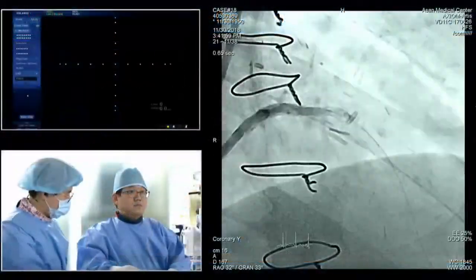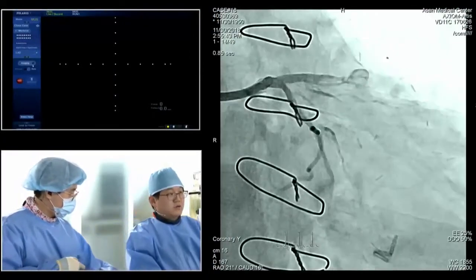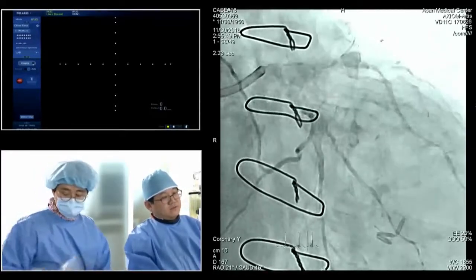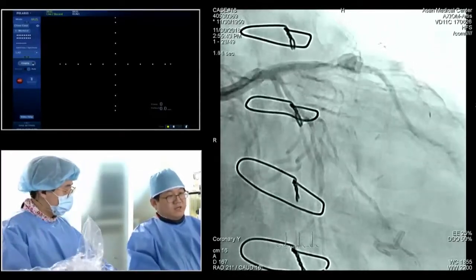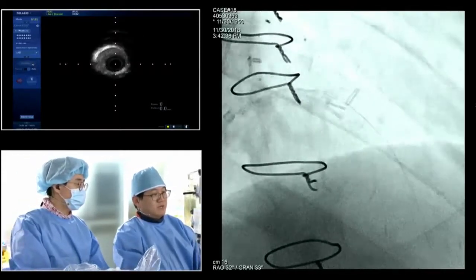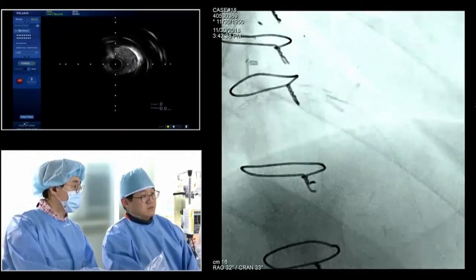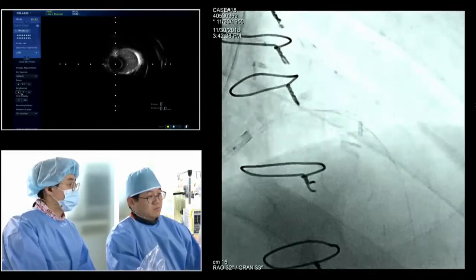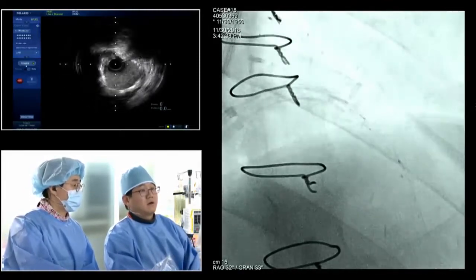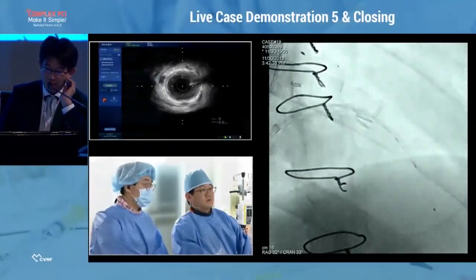But the target portion is not only the eligible area, but also the proximal and left main diffuse disease. So DCB only in a large vessel is not a good option because the large vessel, left main proximal, has high risk of recoiling. So I believe for the procedure we have to implant some kind of stent. After stenting, how long do you use dual antiplatelet therapy in this case?